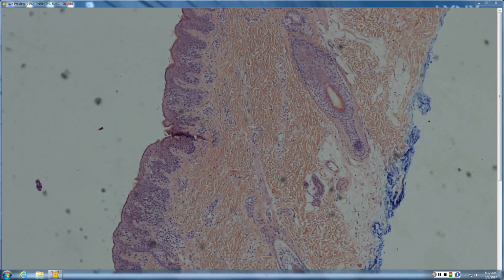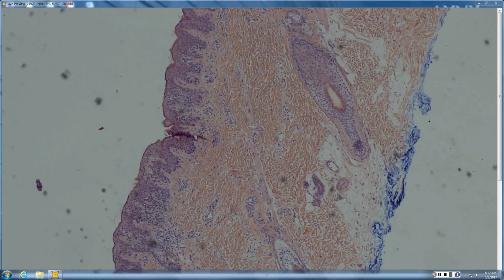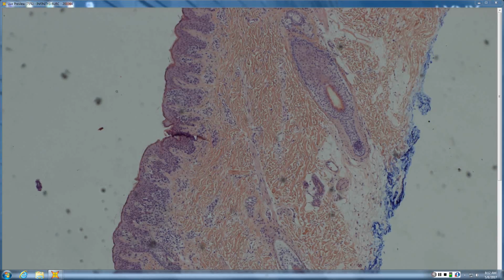You know, this particular one probably originated from hairline in a child. See how small and red the collagen bundles are. So, hairline, and this actually for a hairline nevus or a scalp nevus in a kid is pretty tame. You know, they all look like moderate to bad atypical nevi, even though their behavior is completely benign. But well done. Well circumscribed, nests at the tips and sides of rete.